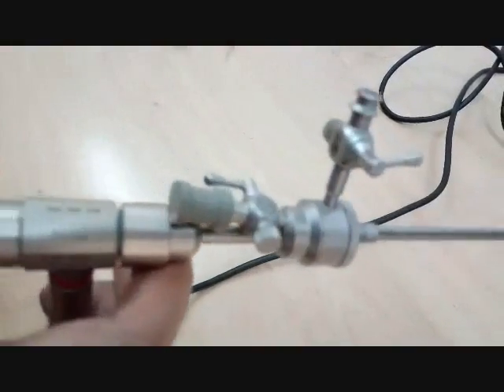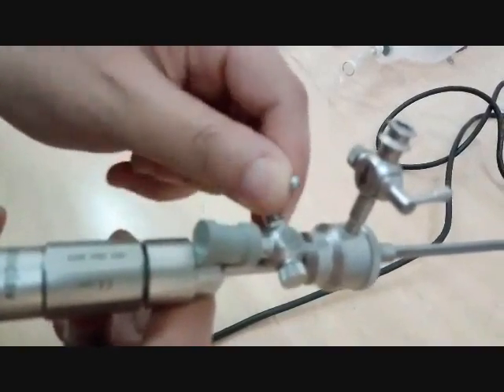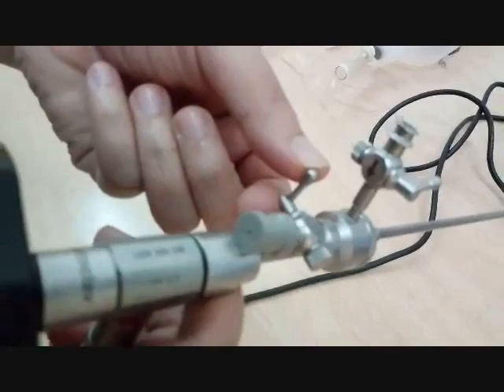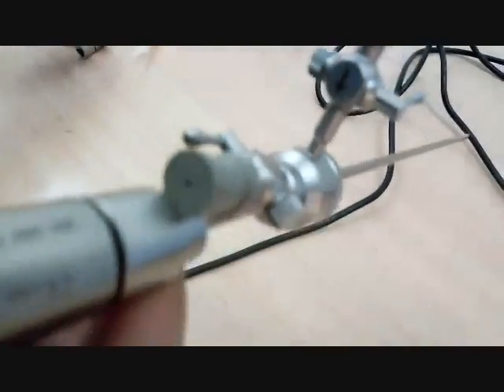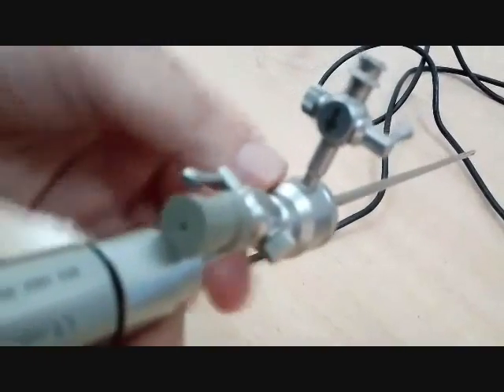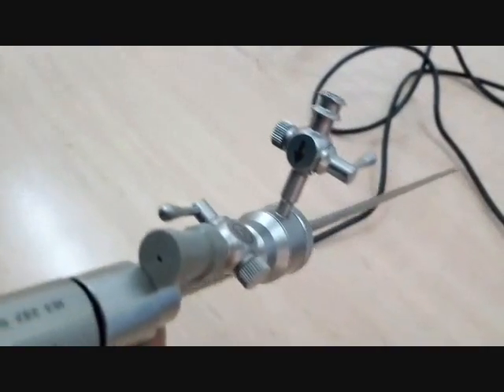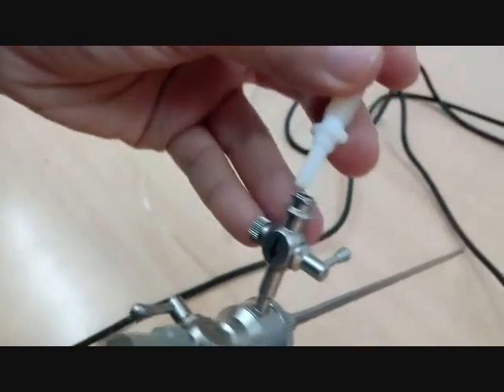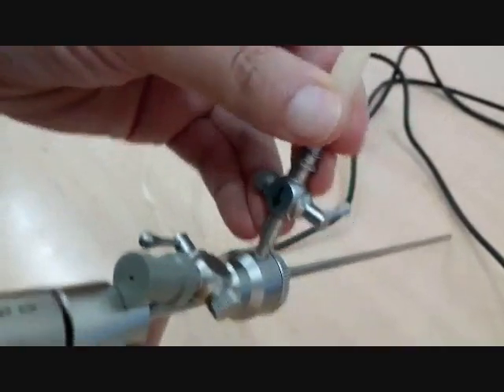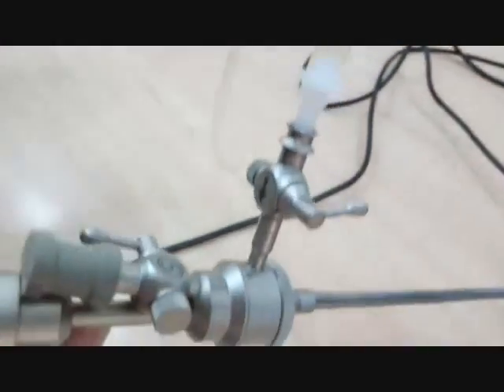Here. With its irrigation connector, the working channel, supplied with a stopcock, we close it here. The instrument cannot go through, and we open it. So, we don't forget the irrigation tube that we insert in the connector, in its right connector. The stopcock is closed, look, it's perpendicular. And here's the normal saline.